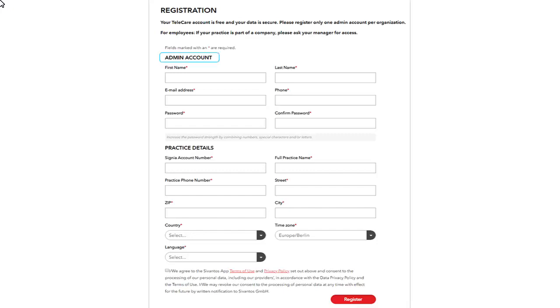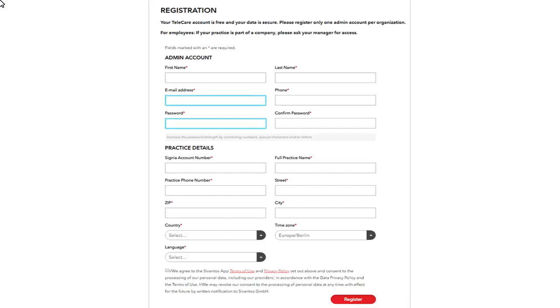The menu admin account will create the administrator account within your company which allows you to manage your practices and create new users as well as new practices. The email address and password you define serve as your login information in the Telecare Portal.